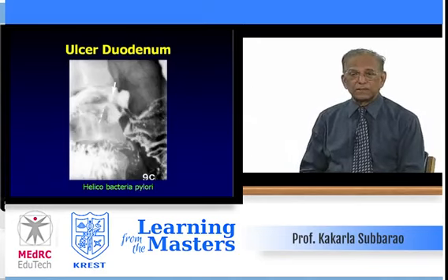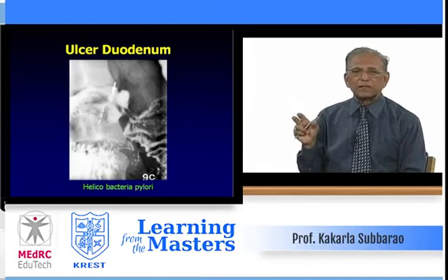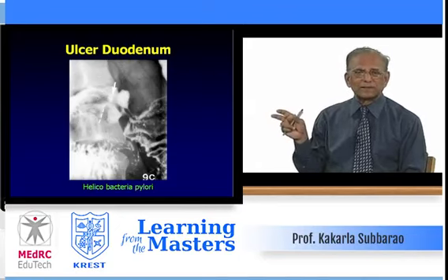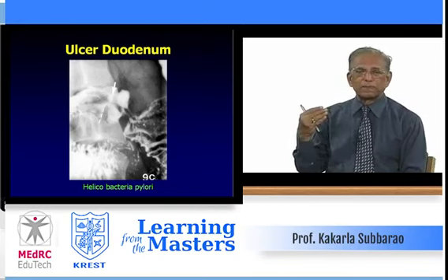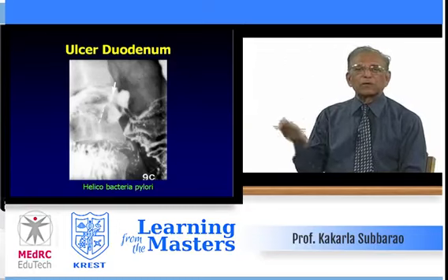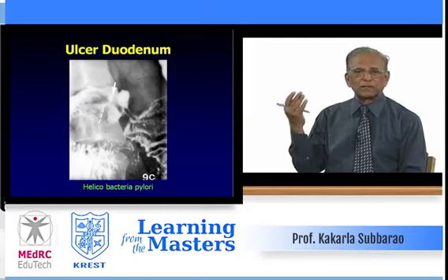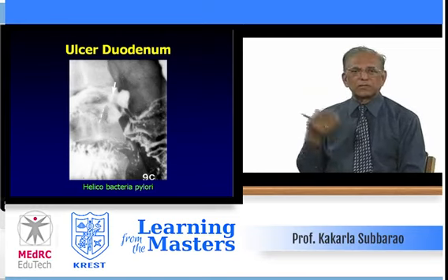Duodenal ulcers, active and chronic. For these, you need an artful radiologist to demonstrate the ulcer. We have patients use spot films and various oblique techniques to demonstrate the ulcer. Of course, endoscopy has reduced most of the frequency of barium series and upper gastrointestinal series.